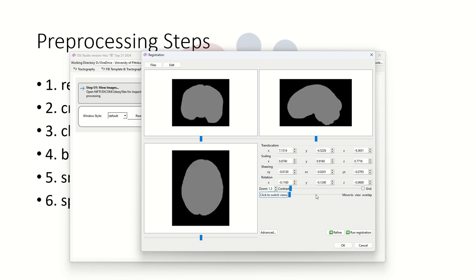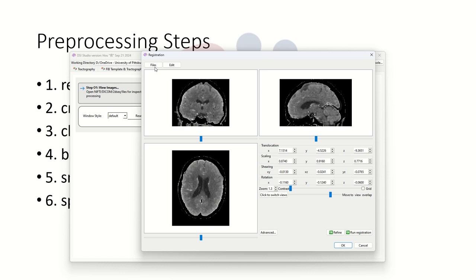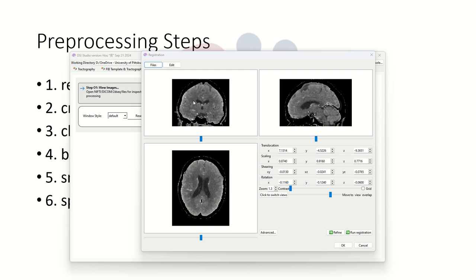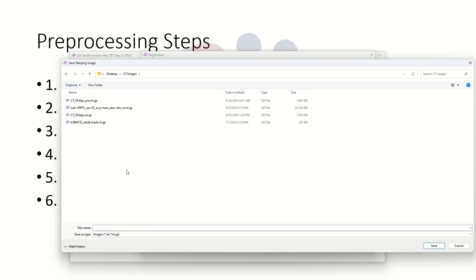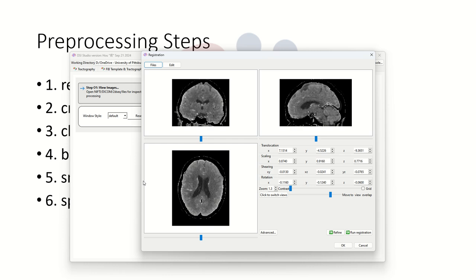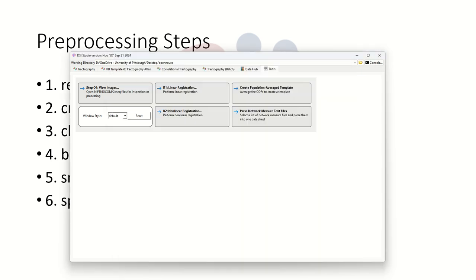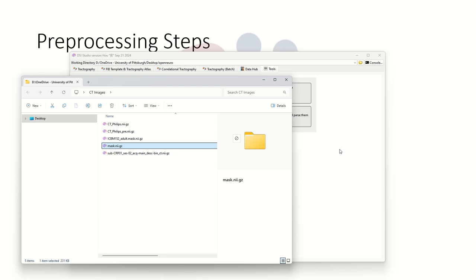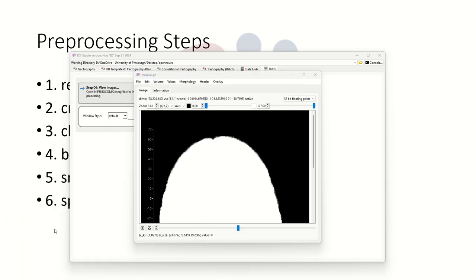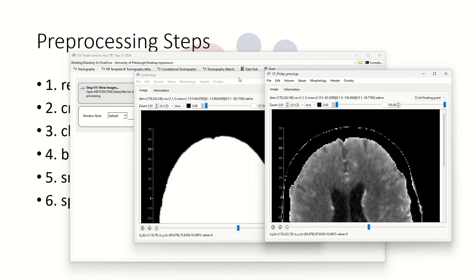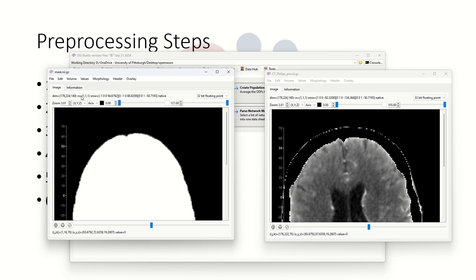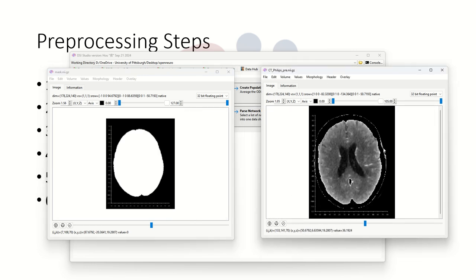Once roughly aligned, go to the Files menu and click Save Transformed Image — this saves the mask that has been transformed into subject space. I name it mask.nii.gz. Comparing this saved mask with the pre-processed image, you will see they have the same dimension and voxel size, meaning these two are already aligned in the same space.